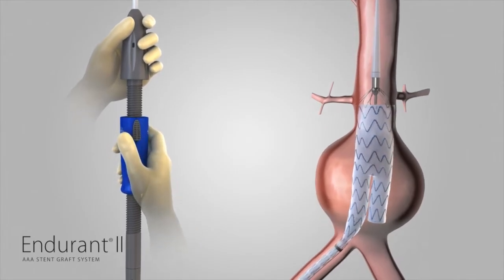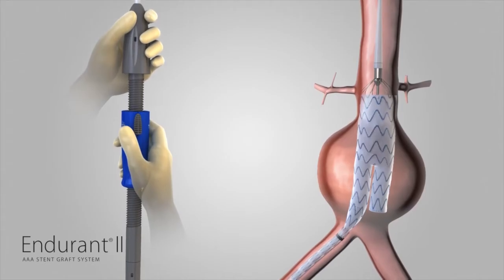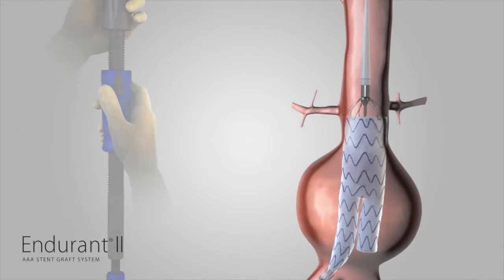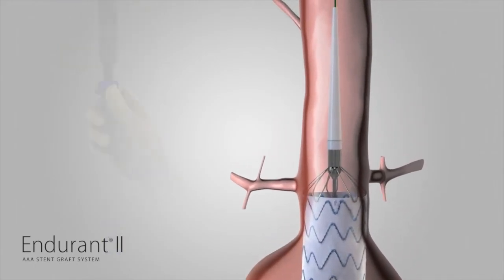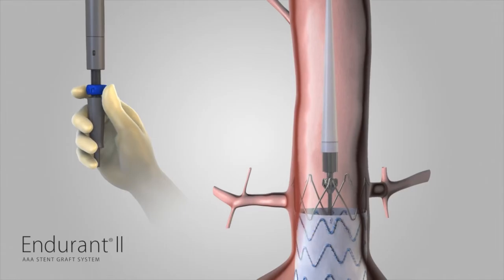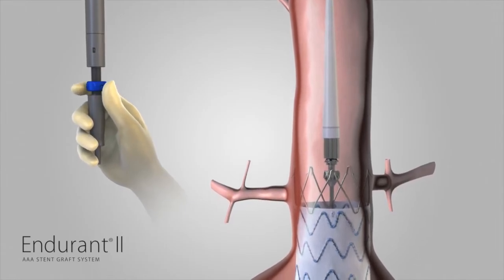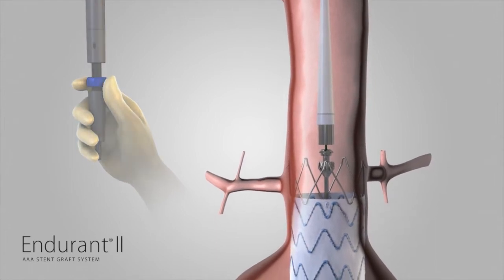Use angiography to verify the position of the bifurcated stent graft in relation to the renal arteries. Continue to hold the delivery system stationary with one hand on the front grip. With the other hand, rotate the back end wheel clockwise in the direction of the arrows to release the suprarenal stent with anchoring pins. Continue turning the back end wheel until all parts of the suprarenal stent are completely clear from the spindle of the delivery system.